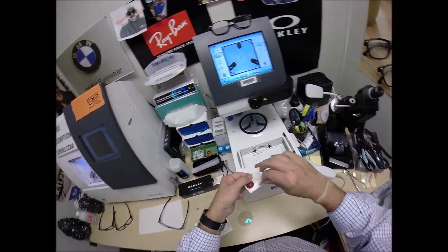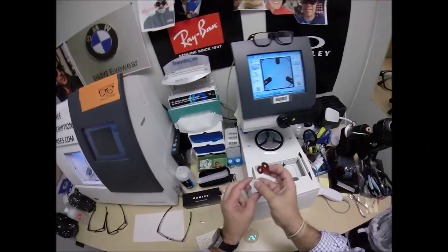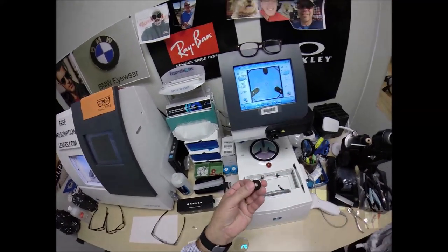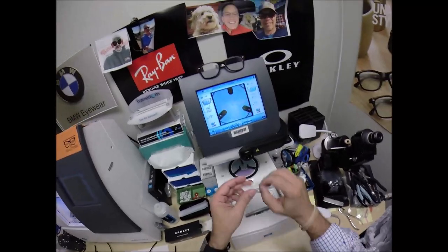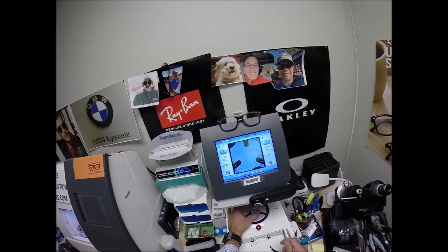So I have two double-sided adhesive stickers here that need to go onto the block. I'm going to stick this one onto the first one. Do the same thing now for the second one. Pull the paper away to make the black side sticky. That little silver button on the back is a magnet. It's going to do its job twice. The first time it's going to attach itself to another magnet there in the arm. And I'm going to get this laid out just perfectly.